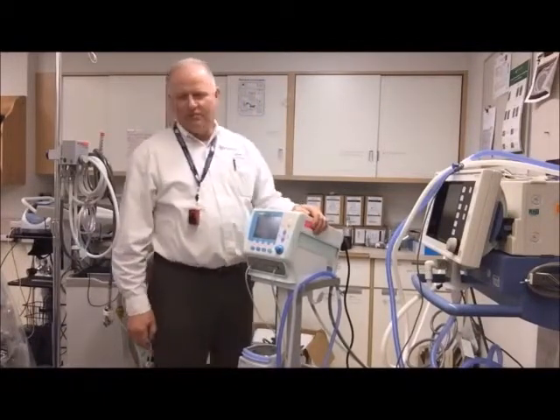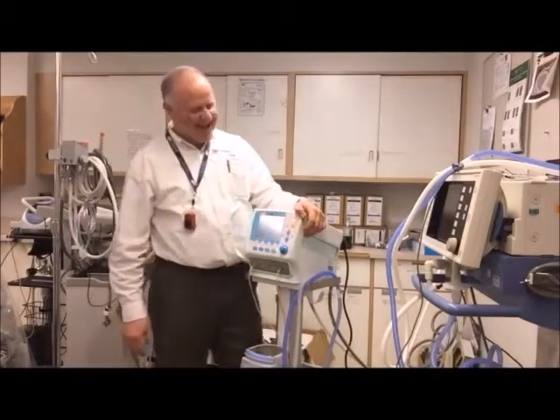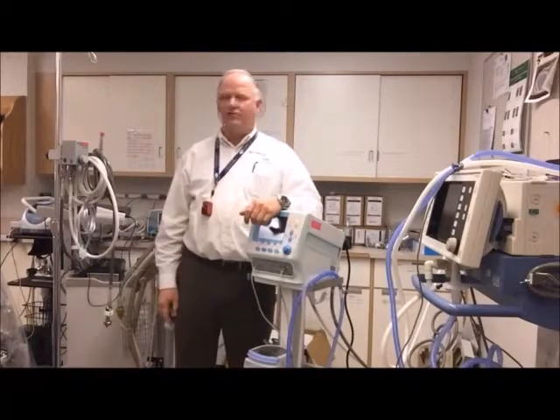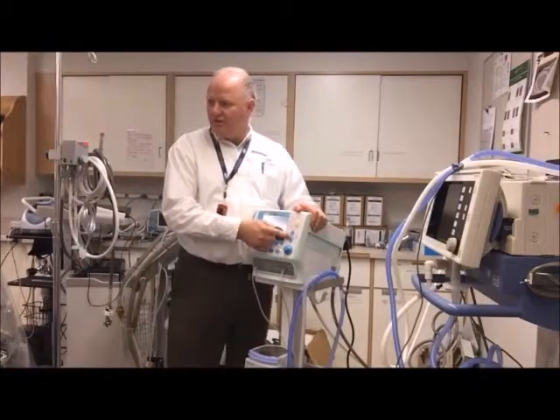Here is your oxygen flush, and here is your manual breath button. If you want to give a bigger breath, do a recruitment or something like that, you can use that. This button is just to dim the screen, and this one brightens the screen.